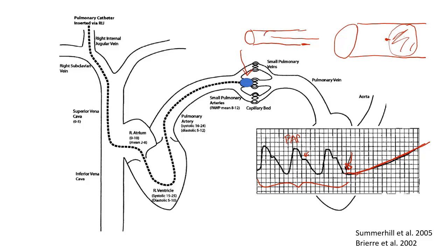What it's going to do is become oblong, like an ellipsoid, and then it can occlude the distal tip of the catheter, and/or push it against the sidewall, and you'll get this very steep rise in the pressure. So this is very bad. If you continue to inflate the balloon, it can rupture that artery. So this is what over-wedging looks like. It's very important to recognize.